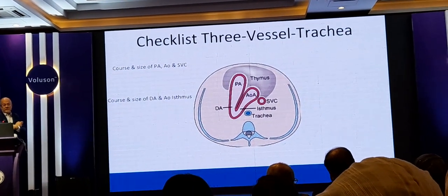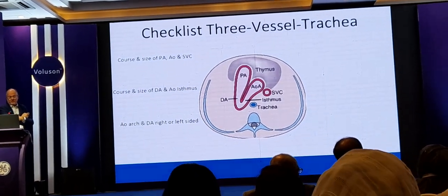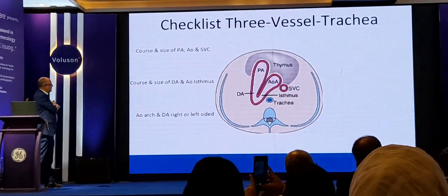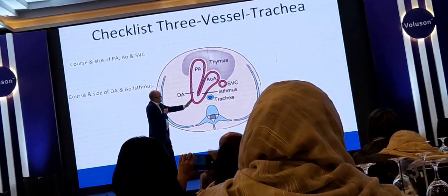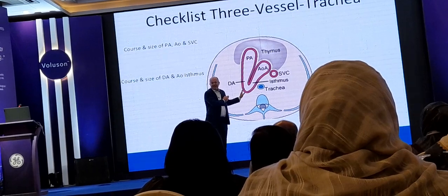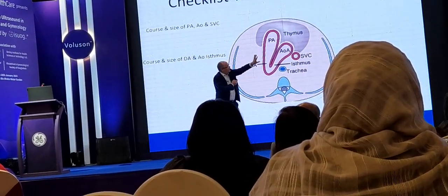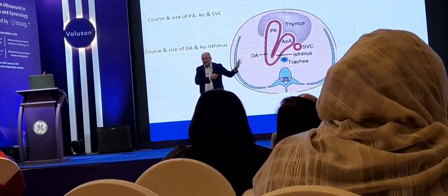We're going to see that you get a beautiful, sharp V shape, aortic arch, and ductal arch. Where are they? Which side is this correct compared to the spine? Left. The aorta is coming out from the heart, up like that, going down. Always think in 3 dimensions. Remember, the aorta goes down the left side of the spine.